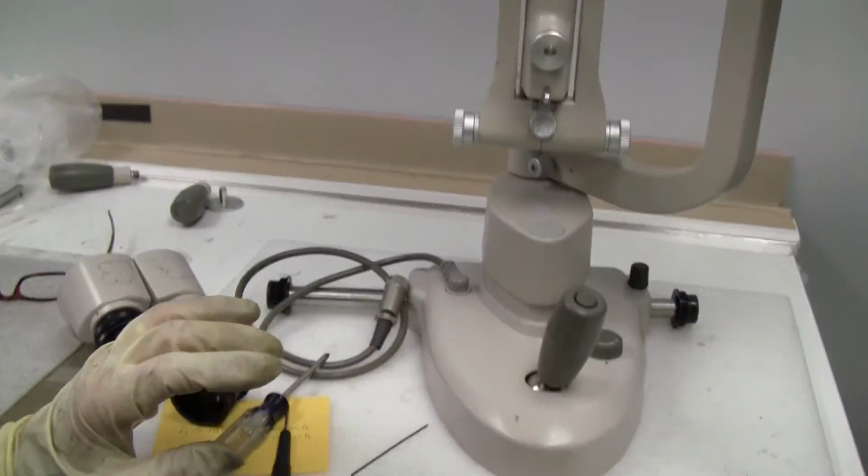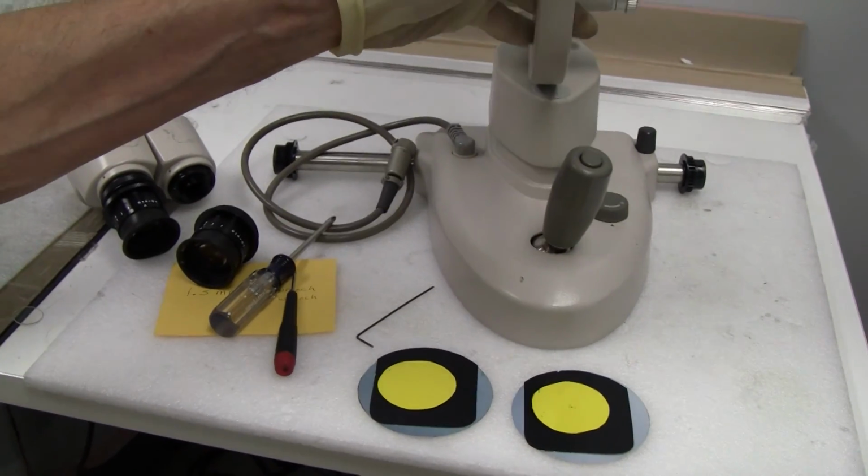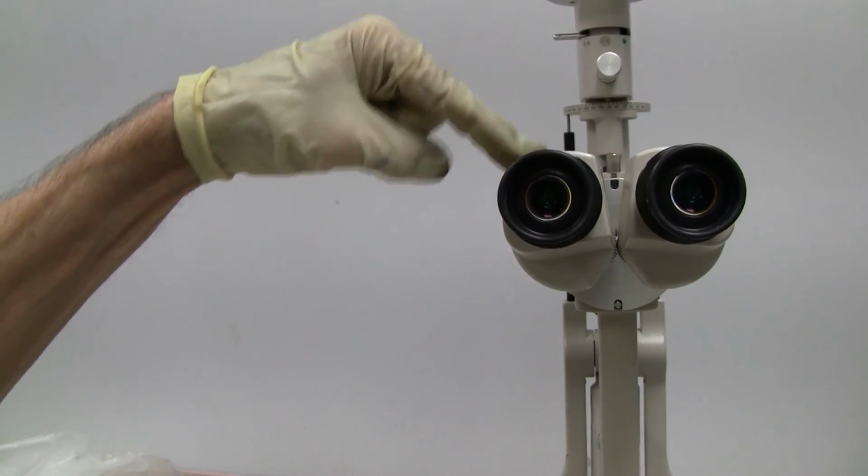That's if both eyes are out the same. But if one eye is different than the other, that's when you would need to adjust the head, one side or the other.